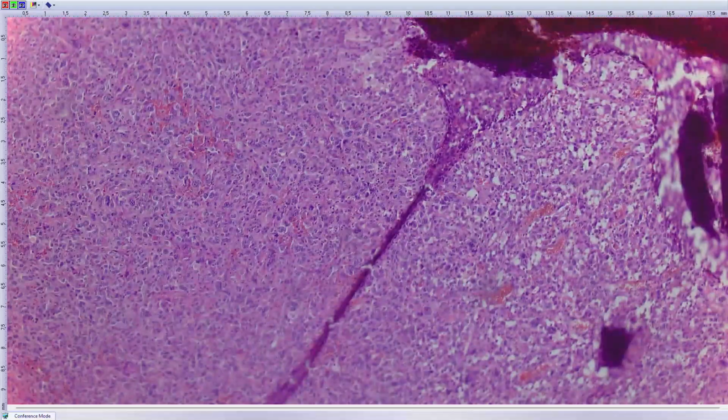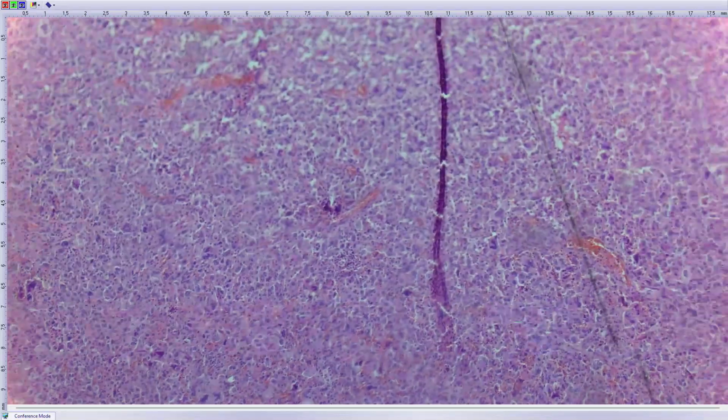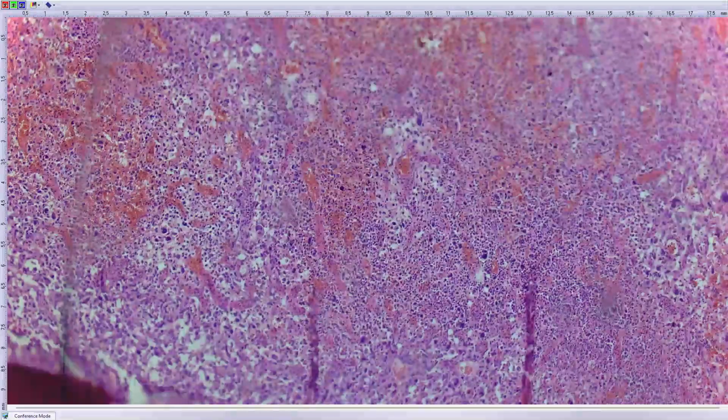Sometimes you see quite prominent pleomorphism. Very typical of undifferentiated melanoma morphologically is that you see various growth patterns. You can see spindle cell areas at one side of the tumor and undifferentiated round or epithelioid cell areas in the other half, or pleomorphic areas somewhere in the middle. So this mixture of various growth patterns is sometimes helpful.